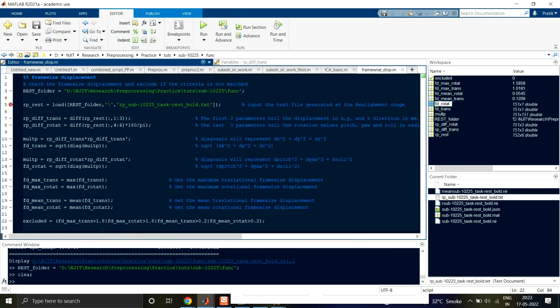I have to do some analysis after pre-processing, right? So after pre-processing I should have enough subjects so that the results are meaningful. So we can decide the threshold based on the data set.